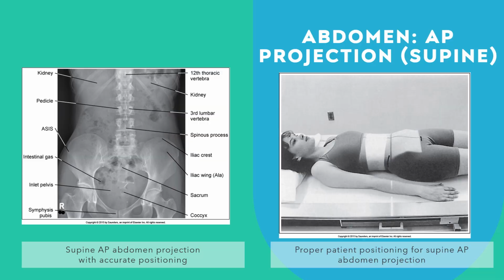Abdomen AP projection supine, aka KUB. Here is an image of correct positioning and a picture of the centering and positioning of the patient.